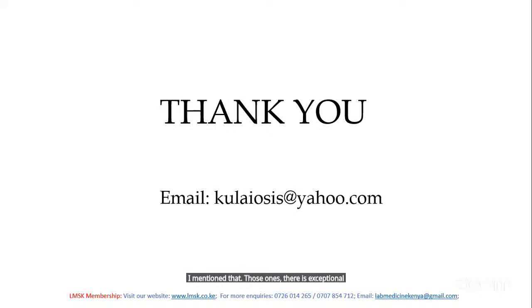In fact, CSF is labeled as an emergency test. So there's an exception for that. And why there's an exception also: in most cases, those specimens are very few, you can get one or two, which will also ease the mix-up. Thank you. Thank you very much. Mabel, I hope that you've got that. Very important.